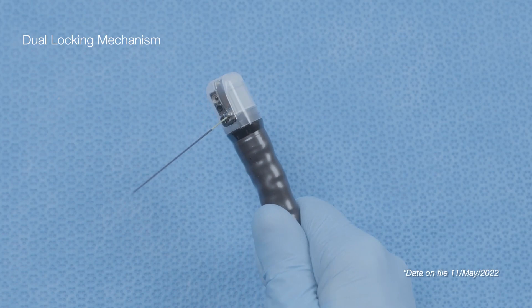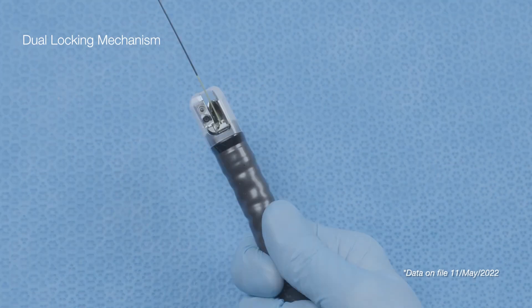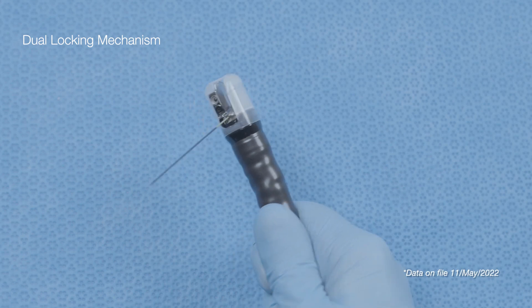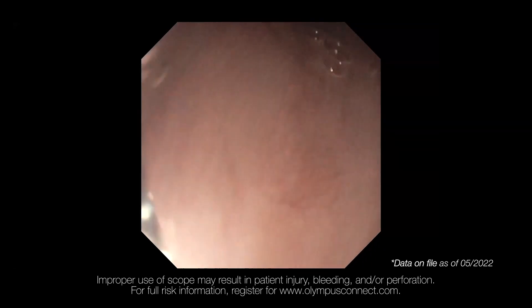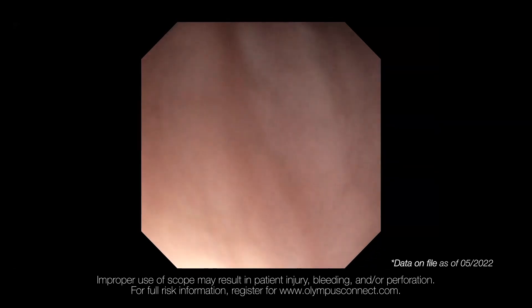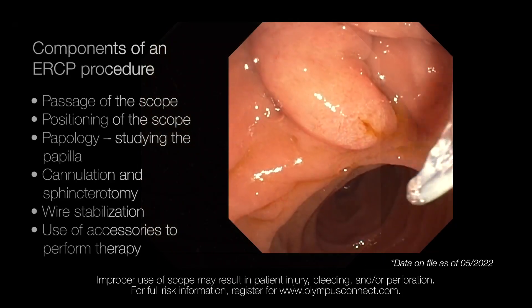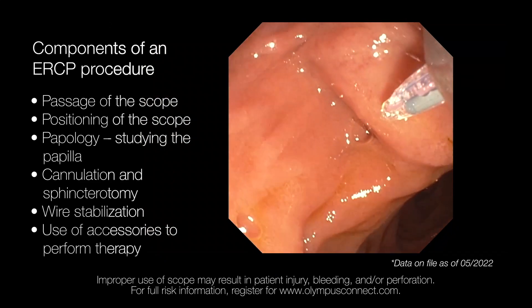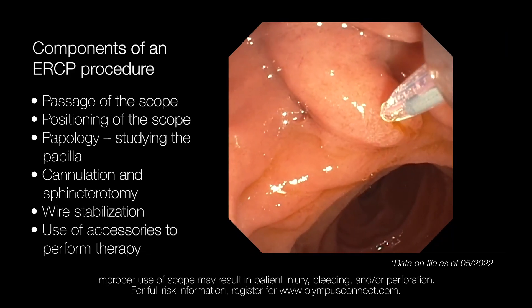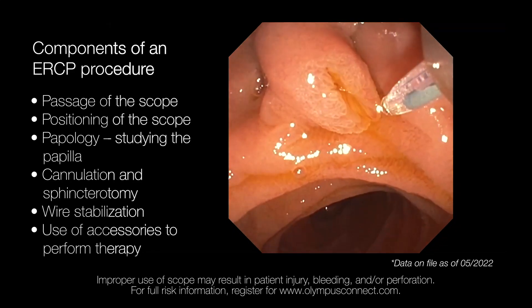The TJF Q19TV duodenoscope has a dual locking mechanism at the distal end that locks and holds guide wires, and this mechanism works for both long and short wire accessories. Moving towards the procedural aspects of ERCP, there are different components including passage of the scope, getting into the best position to cannulate the papilla, studying the papilla after cannulation, performing sphincterotomy, wire stabilization, and use of accessories to perform therapy.